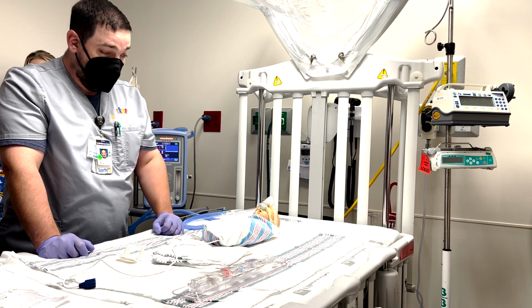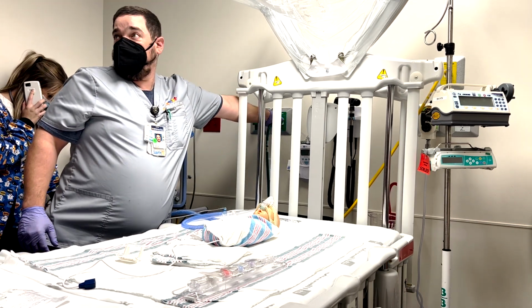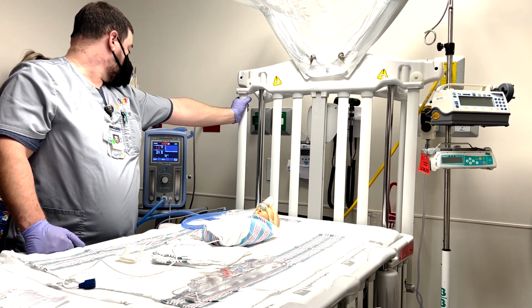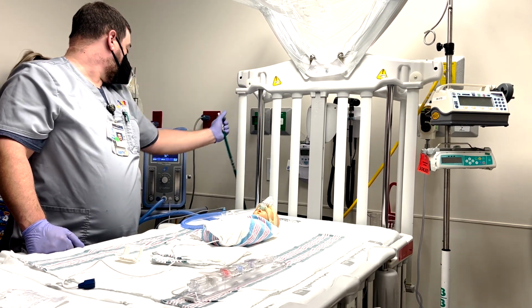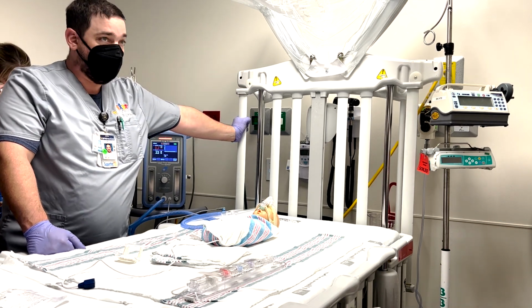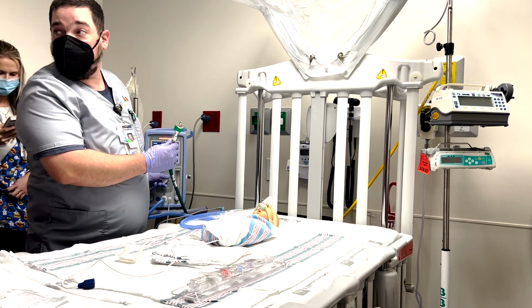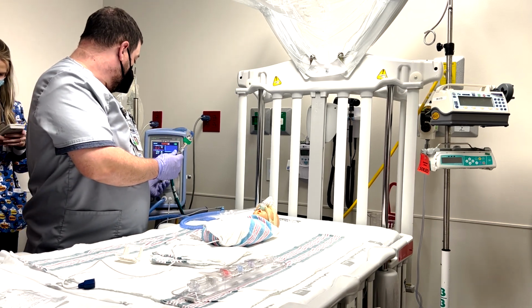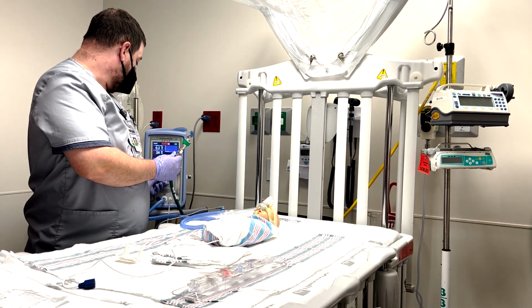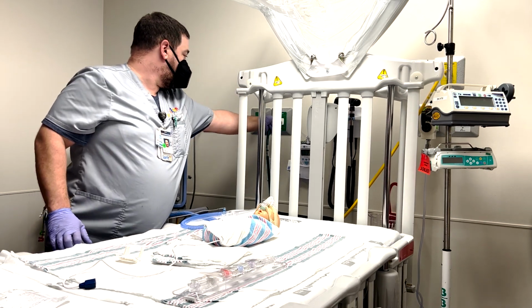Okay? So, what happens if you hear this alarm? That was probably a bad example. Something's not right. You've got a problem with either your oxygen or your air. Now, it will run, but what you need to realize is which direction it's going.